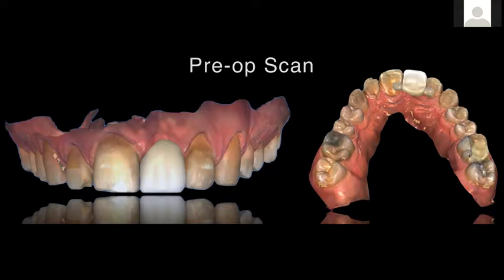This is going to then act as our provisional restoration because since this was going to be a narrow diameter implant, we did not want to immediately temporize this implant because you're also going to do some connective tissue grafting. So there was a lot of surgery involved. Here he fabricated preoperatively a Maryland bridge, and our goal was, if we could place this implant flapless, because the way we planned it we could avoid the bone grafting, then we could do a custom tissue former on this implant under this Maryland bridge and have the bridge still be in place.